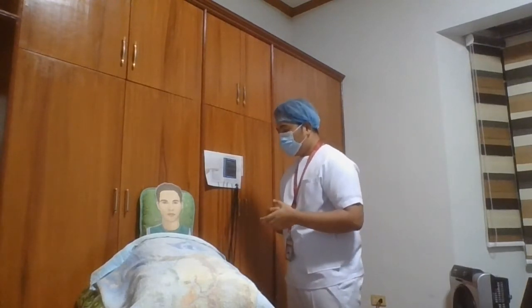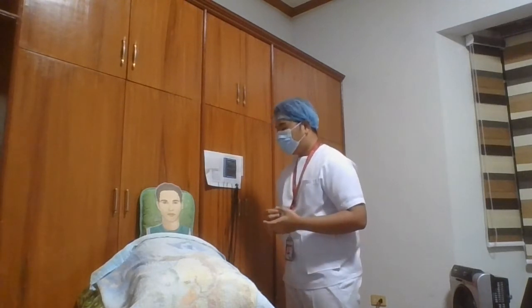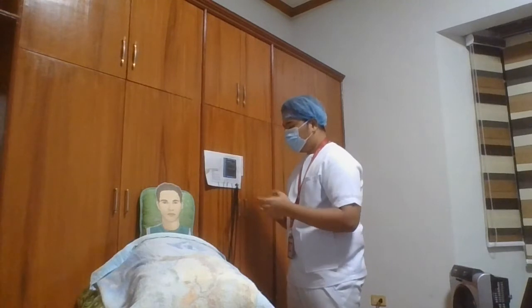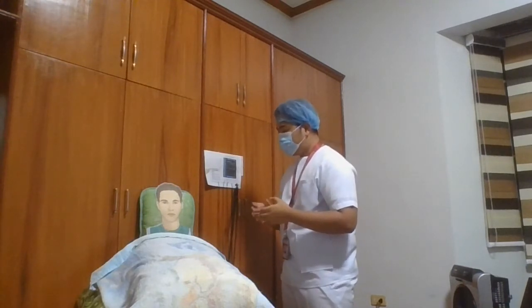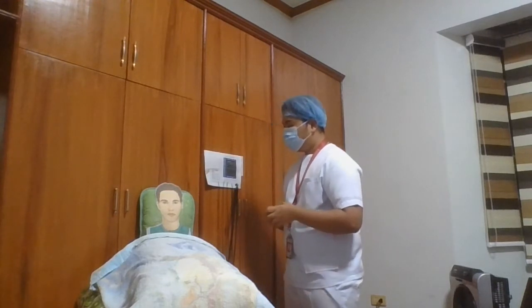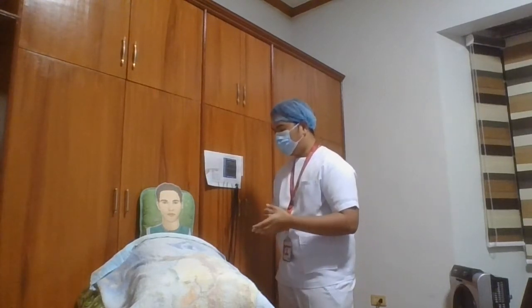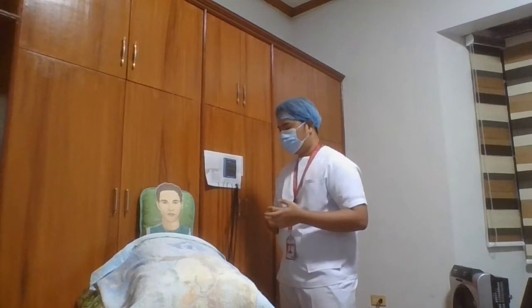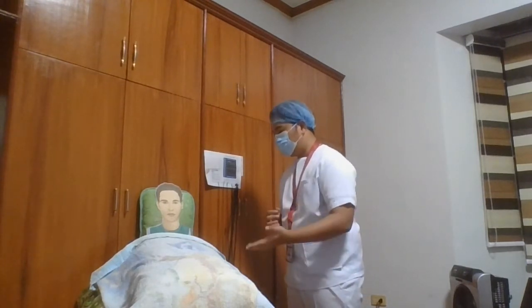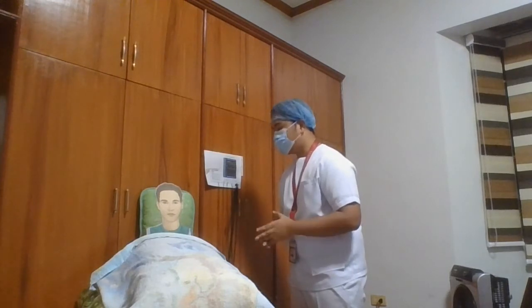Today, we will be checking your heart's rhythm and electric activity through the ECG. But first, we have to place these sensors attached to your skin in order to detect the electrical signals produced by your heart each time it beats. Sir, upon the procedure, you are expected to lie down and just relax. Is that okay?